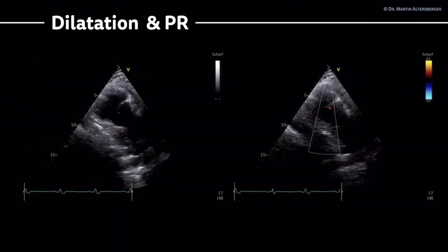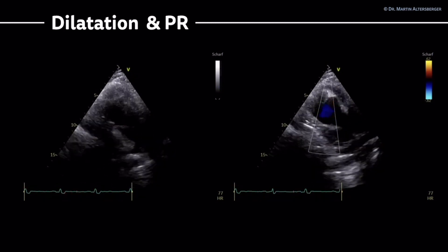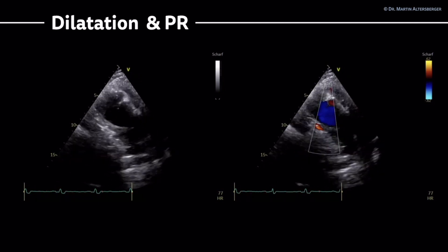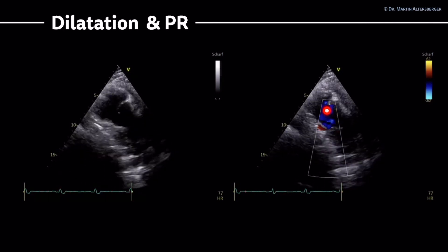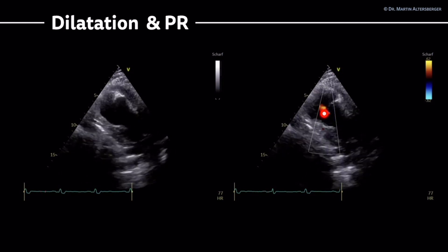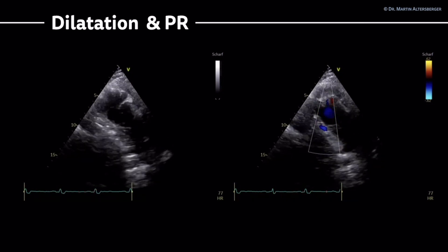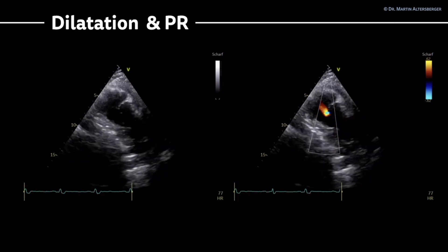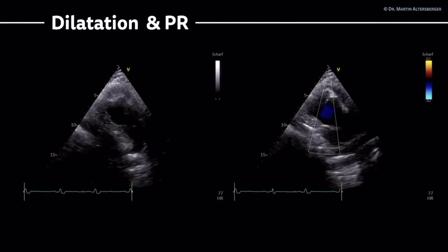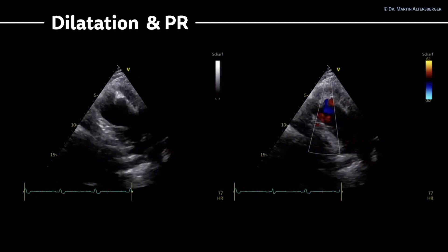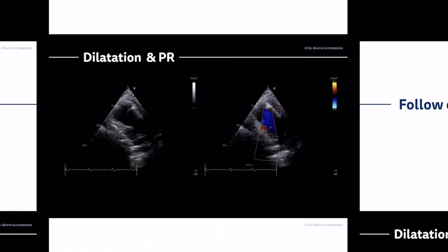To summarize with a pathological example: this is the patient we have seen before with probably reduced right ventricular function. We do see the pulmonic valve, and the opening and closure of the pulmonic valve is different. We do see pulmonic regurgitation — it's definitely not severe. We can see the pulmonic trunk and a little bit of the right pulmonary artery, and it seems to be dilated compared to the other images. With these specific atypical views — which you should try to learn and use in the situations you need them — we will conclude the sessions of the parasternal long axis view.